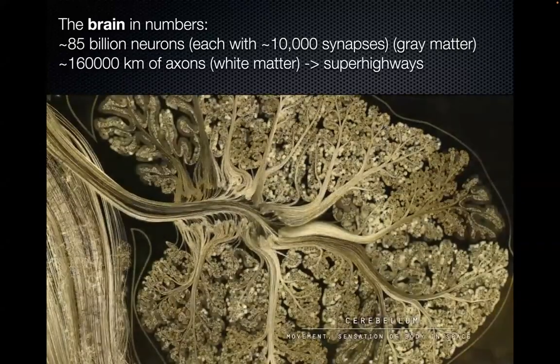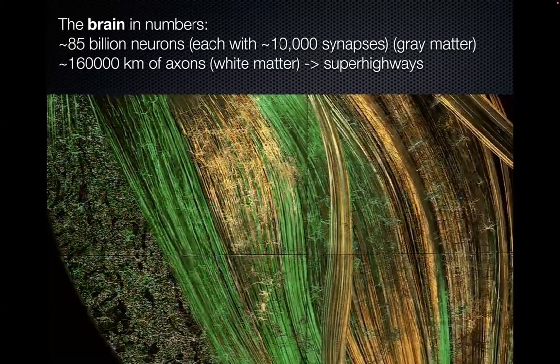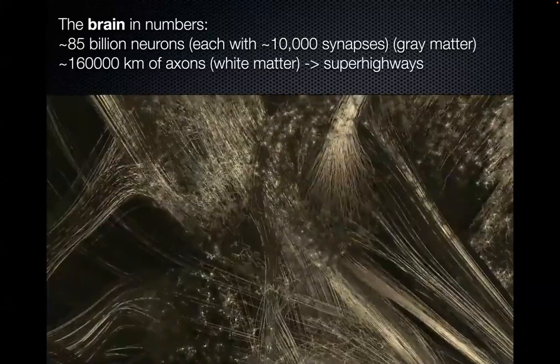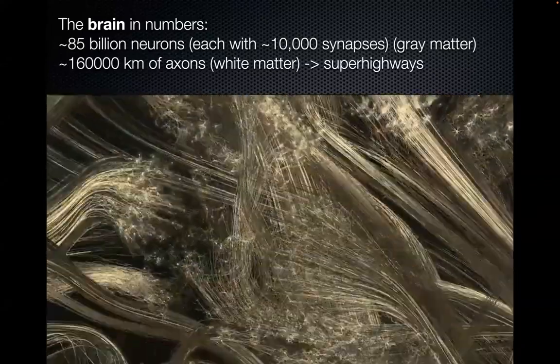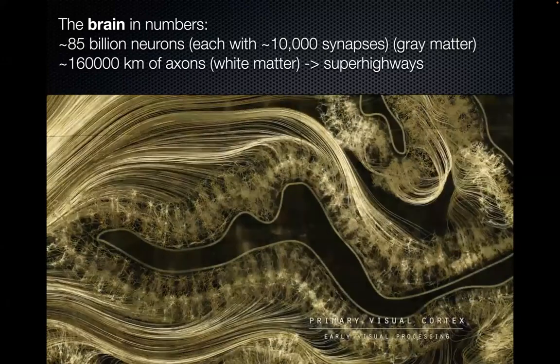Of course, there's a notion of scale, right? I'm not tracking individual axons. We're going to work with MRI and diffusion MRI. So we're on the other end of the spectrum at the macroscopic scale. But if you're in Frédéric Lesage's lab, imaging with two-photon or microscopy of individual axons, well, you can see that these numbers are monstrous.